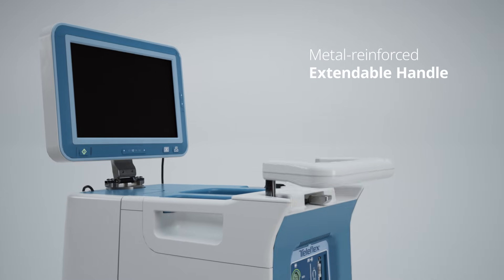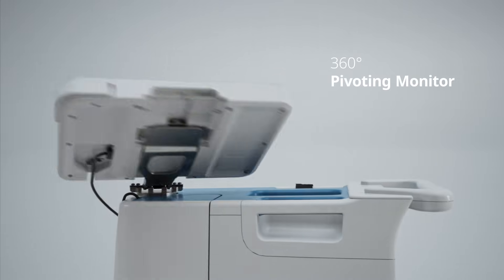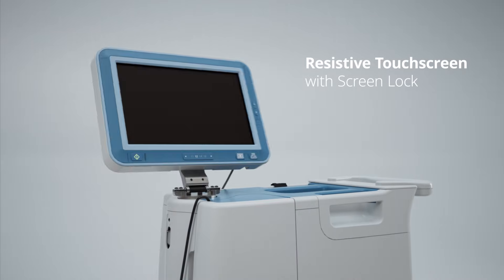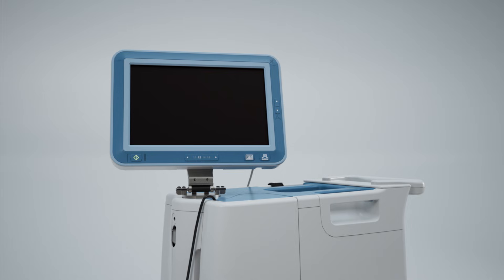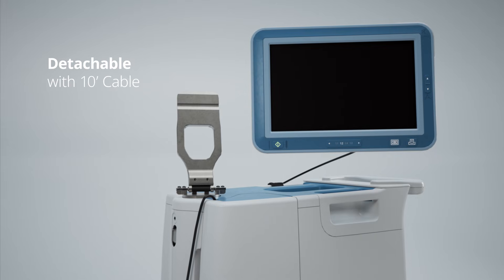A metal-reinforced, extendable handle offers stability and control. And the 360-degree pivoting monitor features a resistive touchscreen with a screen-lock feature to prevent accidental selections during transport. For added flexibility, the monitor can be detached and used within a 10-foot distance.